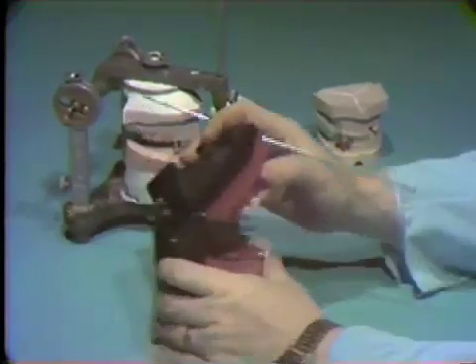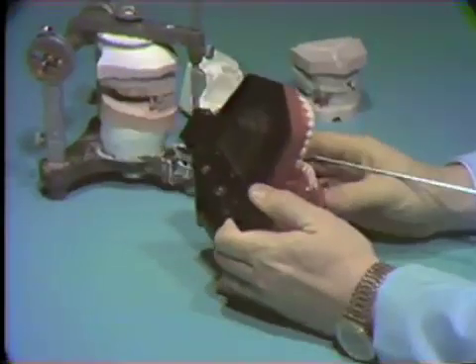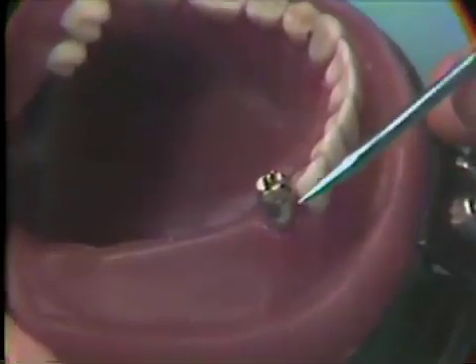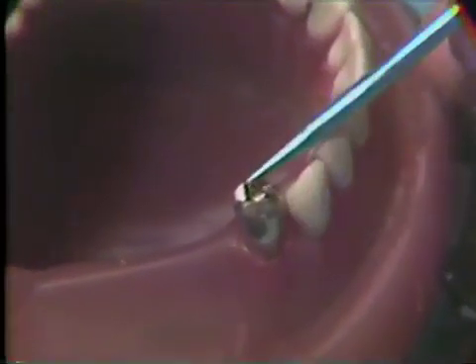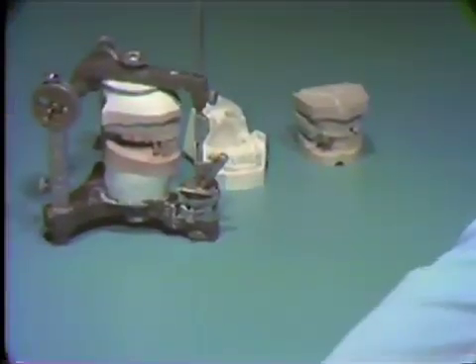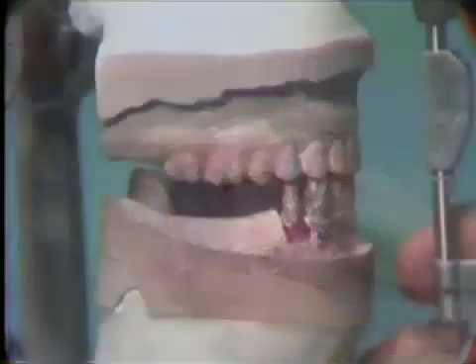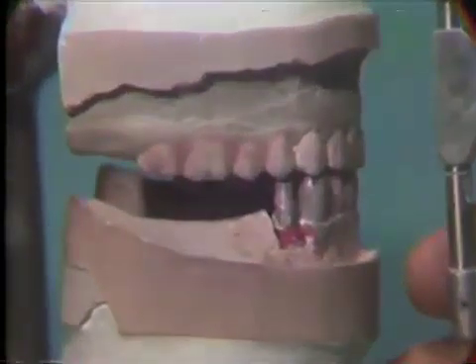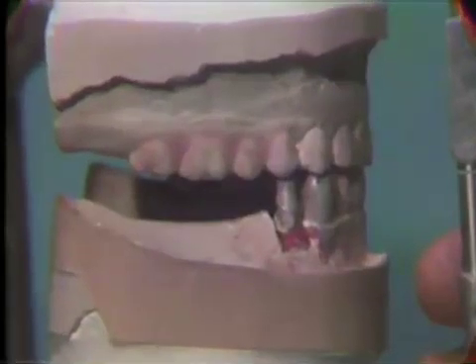The construction of a surveyed crown requires that we not only create proper tooth contour to include occlusal rests, retentive areas, and reciprocating planes, but with the correct articulation and occlusal anatomy. Therefore, the working model with a silver-plated die must be mounted on a suitable articulator to the correct vertical dimension, as well as to the correct centric occlusion and centric relation.